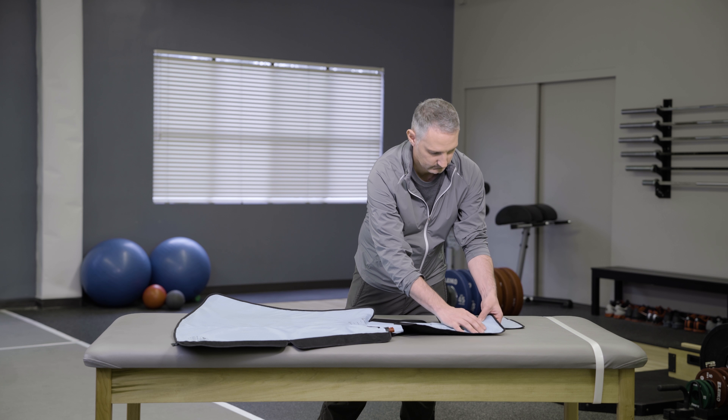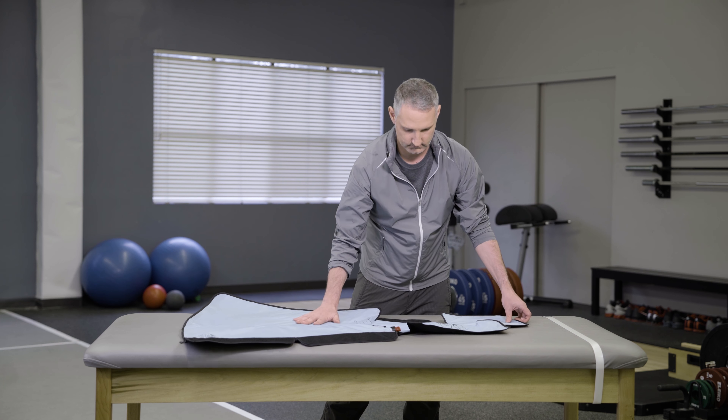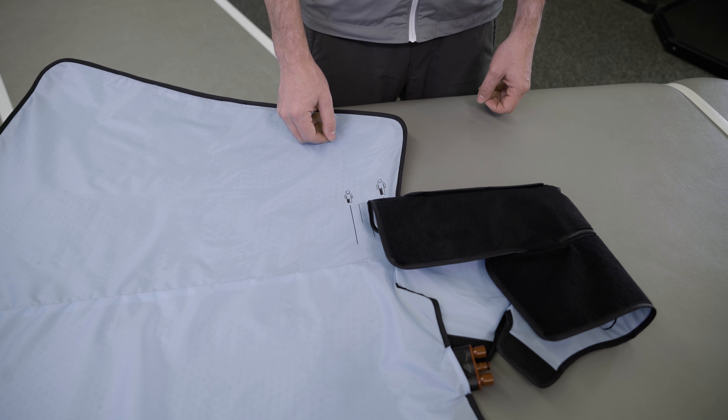Each full leg boot is designed to accommodate various inseam lengths. An assembled wrap comes ready to use with a standard length. You may adjust the length to be either longer or shorter.